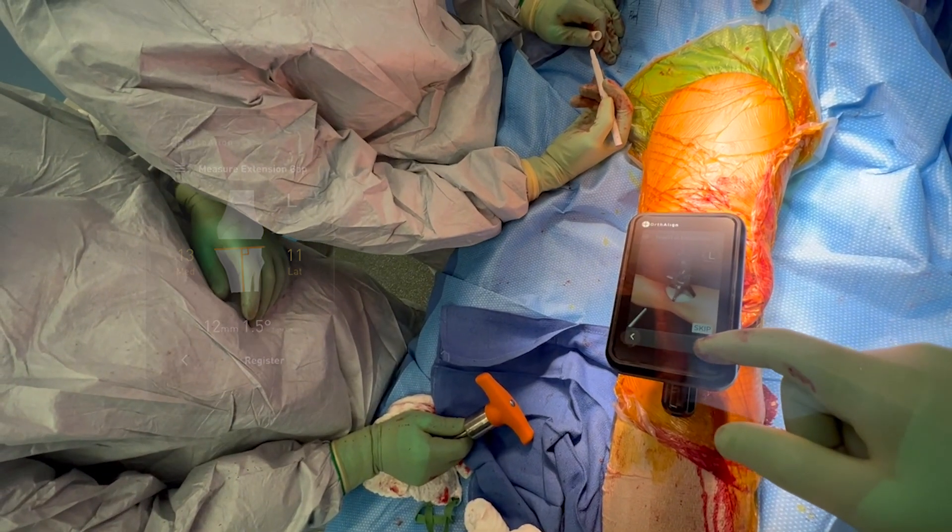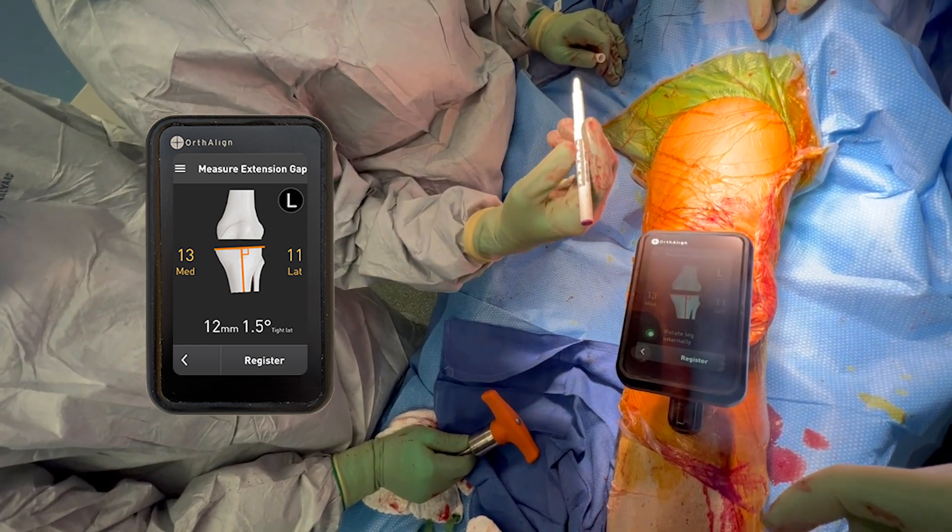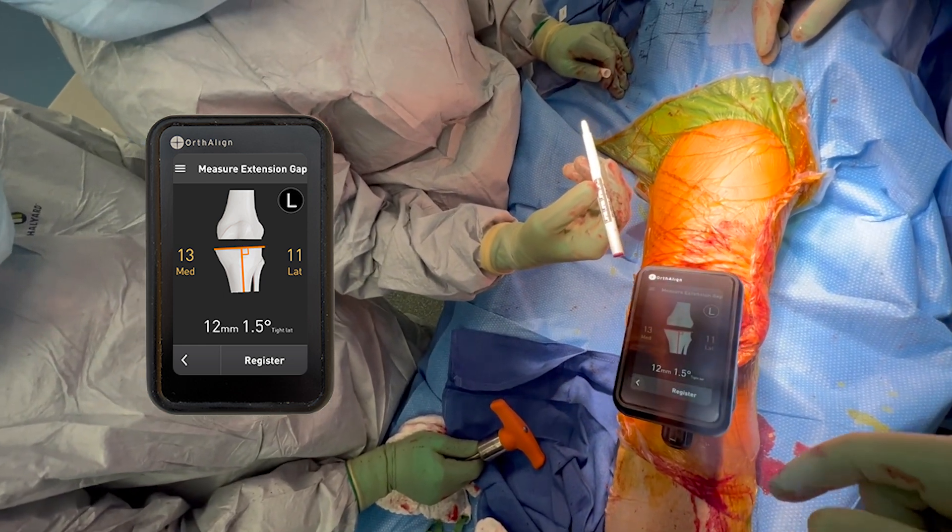We take a read of those numbers, and in this case her space is 13 millimeters medial and 11 millimeters lateral. So she's a little bit looser in extension on the medial side.